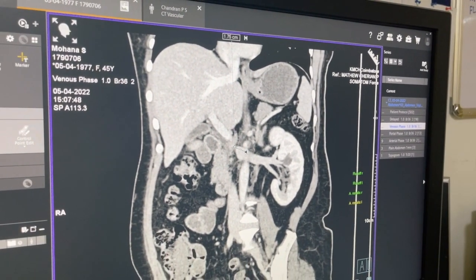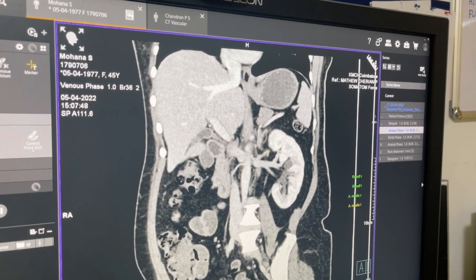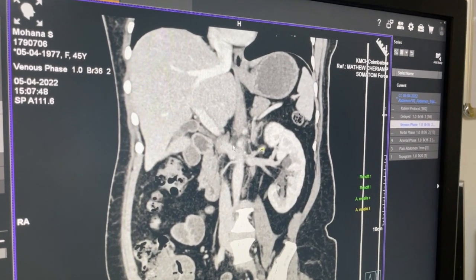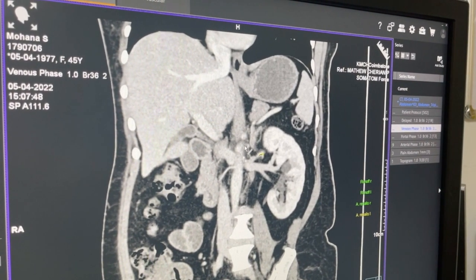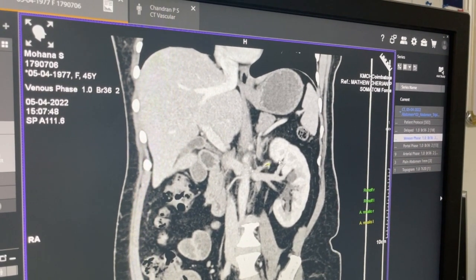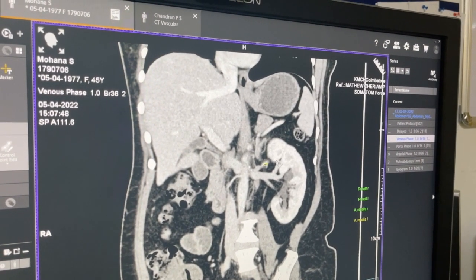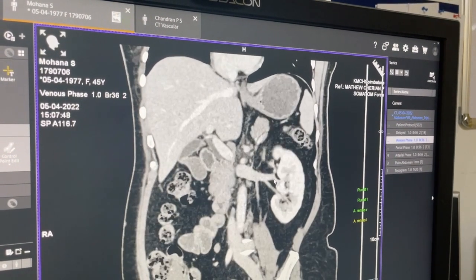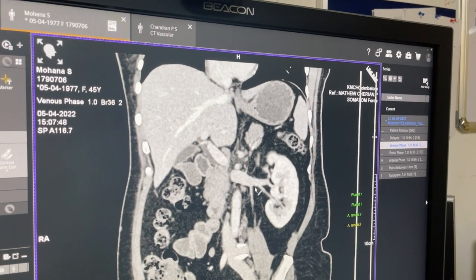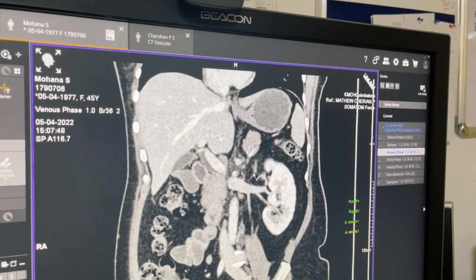Knowing the distance matters if you plan to use a Sim 1 catheter — you hook it and pull it down so it curves upwards into the adrenal vein, injecting contrast to confirm the adrenal blush. My colleague Dr. Santosh uses another technique: he hooks the renal vein with a Sim 1, takes the wire down the ovarian vein (or testicular vein in a male), exchanges for a Bernstein, and turns the Bernstein up. Remember — if the Sim 1 does not work, the Bernstein will always work.